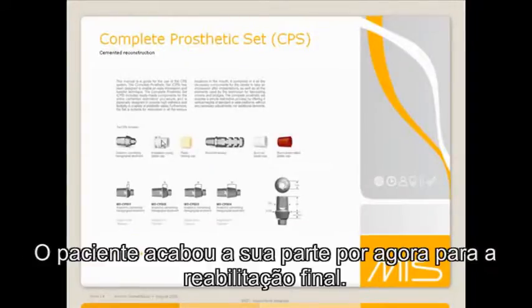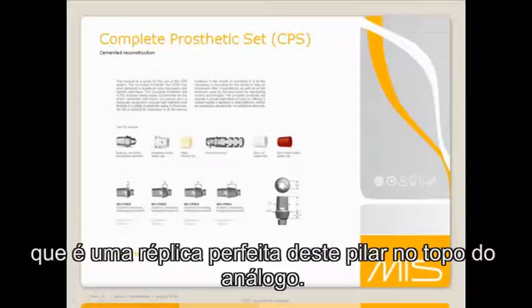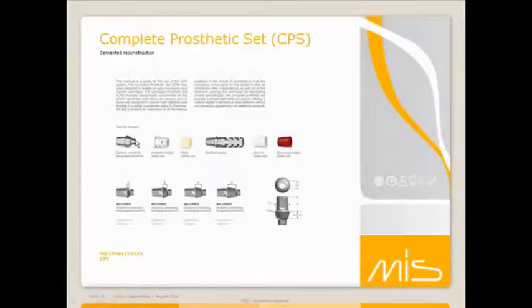The patient is now finished with their part of the restoration for now. You'll then take that impression that you've taken with this plastic cap inside it and send it to the lab along with an abutment analog, which is an exact replica of this abutment on top of a lab analog. The reason you're not going to prep this analog is that it goes in, you torque it down, and basically it's ready to go. You're not prepping it because otherwise the rest of this kit becomes negated, and you can just go ahead and throw it away.